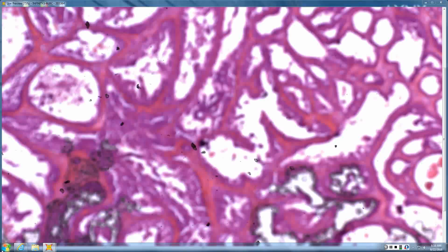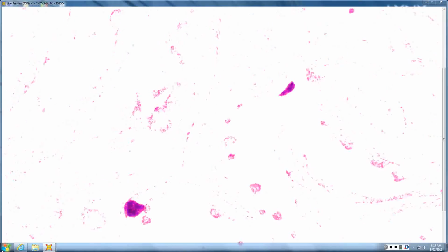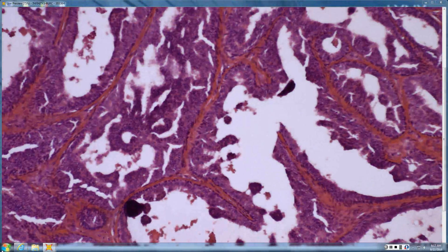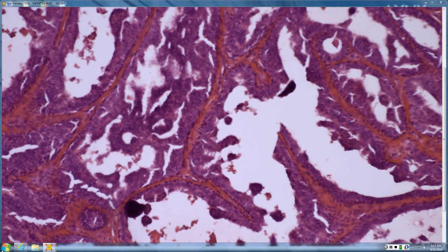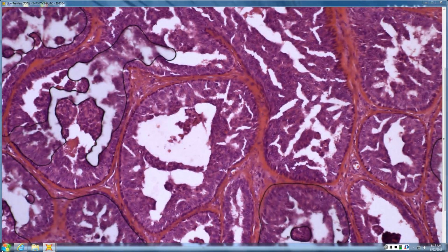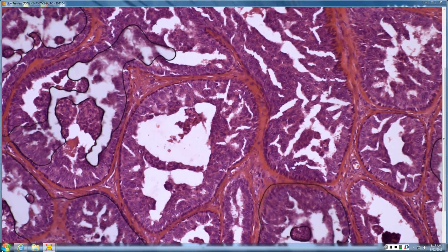And you look higher, you can use a P63, or here it's pretty easy to see just on H&E that you retain a nice myoepithelial layer everywhere, and the epithelium, although it forms tubules, is not highly atypical, so this is more likely a benign intraductal papilloma. What's the clinical name that gets applied to that? Erosive adenomatosis. Because often it looks erosive on the nipple, so erosive adenomatosis or benign intraductal papilloma of the nipple, same thing.